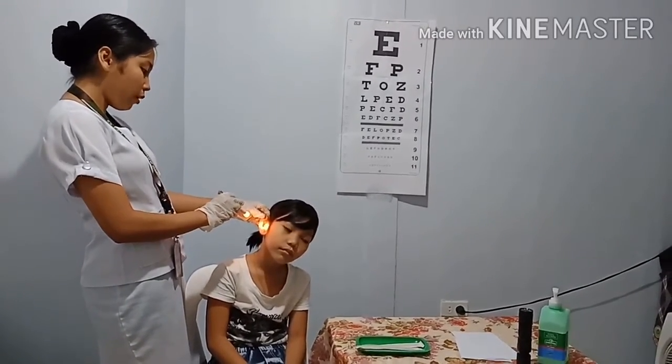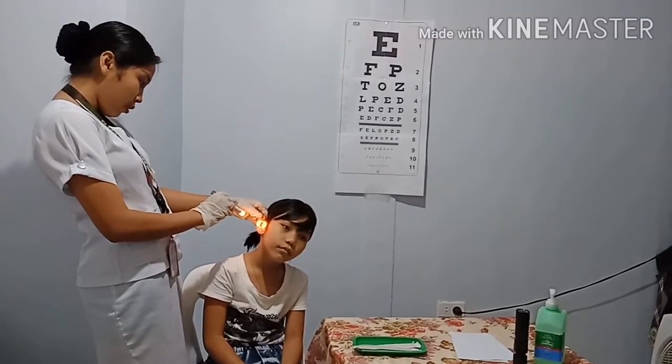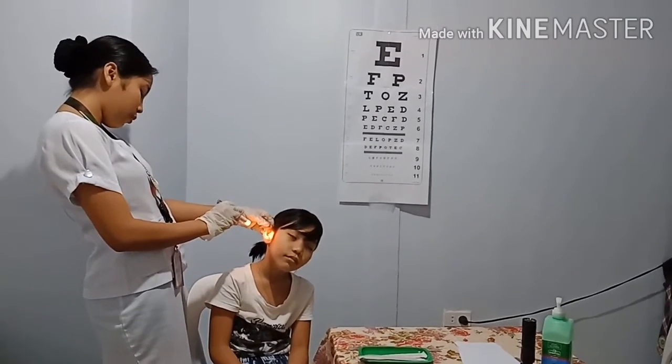Check the other side also if there is presence of cerumen, pus, blood, or lesion. So, there is a presence of cerumen.